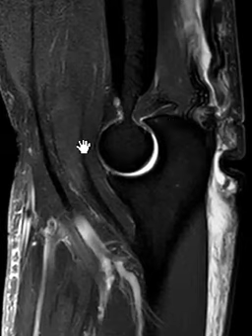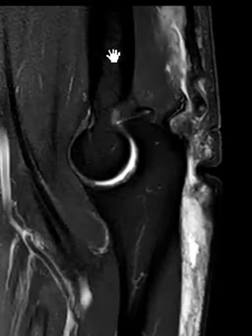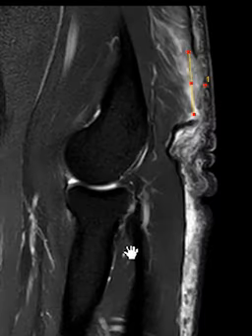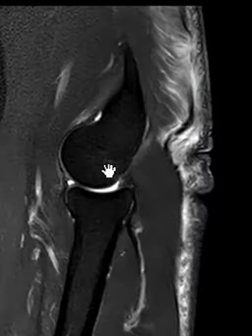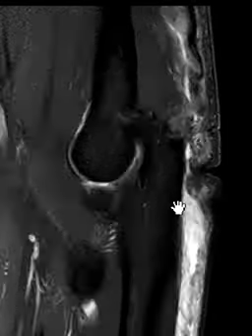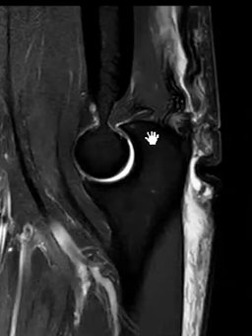This is the antecubital fossa here in the front. This is the humerus coming down, ending here, and this is the ulna, and we can see the ulnar shaft here. This is the radius here. This is the radiocapitellar joint. Looks pretty good. No significant fluid. And here we go, the humerus and ulnar articulation here.